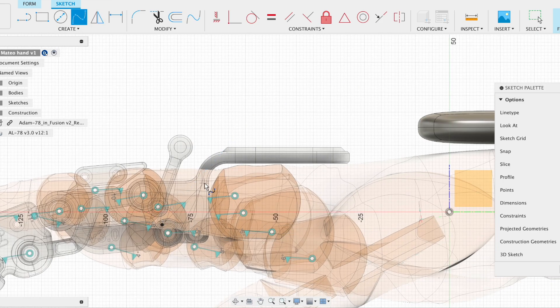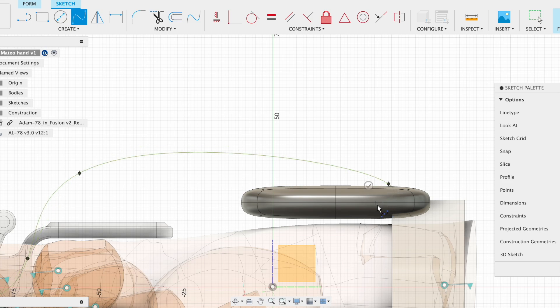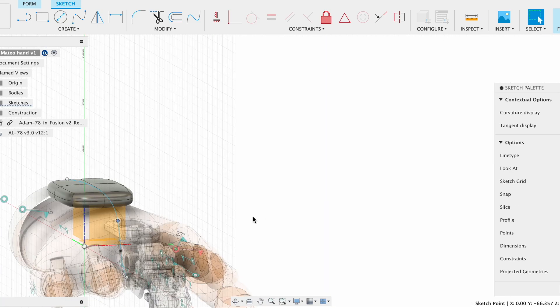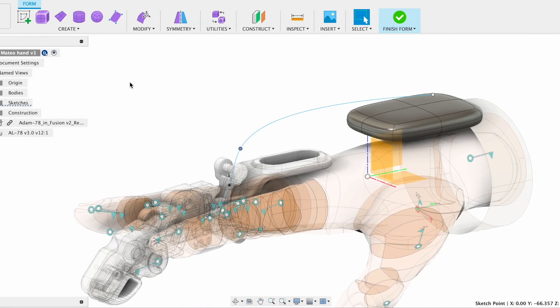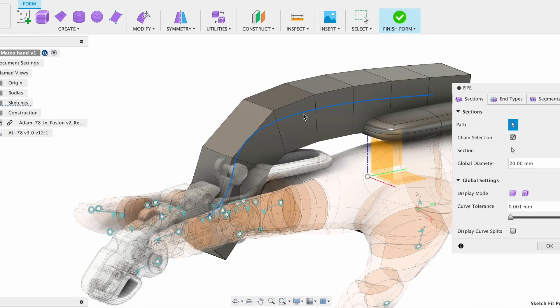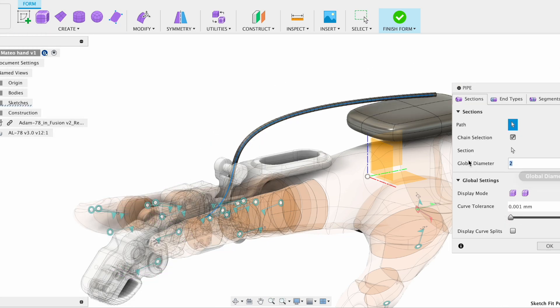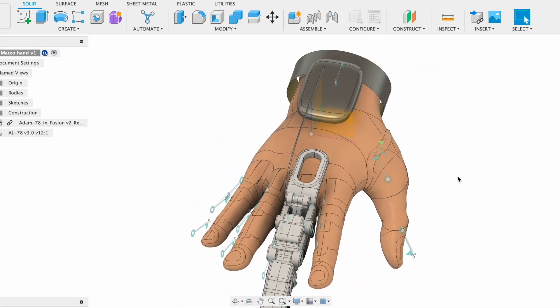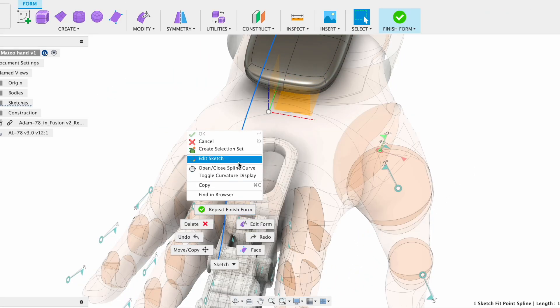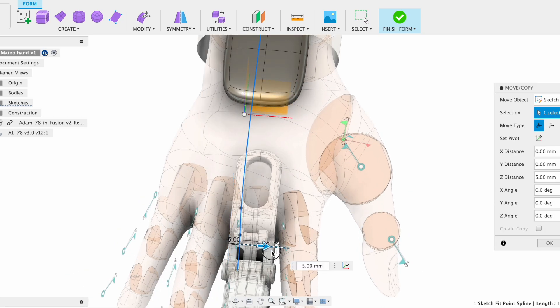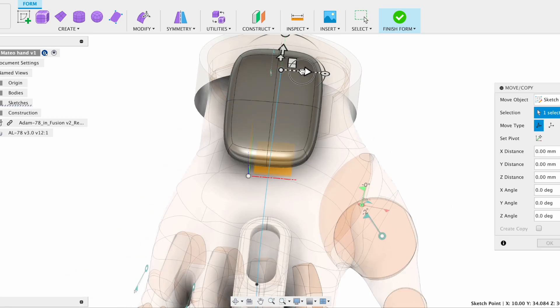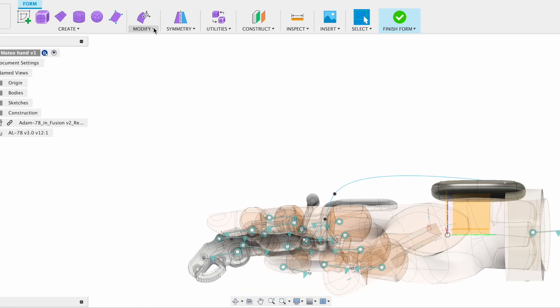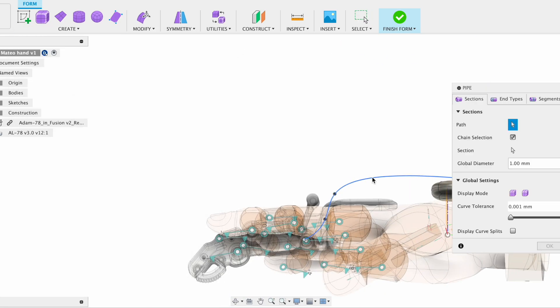And right now since we don't have any string representing how it's going to move, we use the pipe function from Fusion 360's form function so that when everything is assembled in the future, the string on the top part will be connected to the end of the linkage so that the movement of the wrist will actuate the movement of the whole finger.